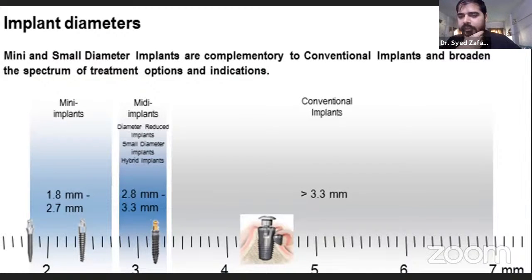Okay, I have covered my topic of flap planning, atraumatic extraction, and how you will extract the tooth, what the protocol is for bony defects, and when you place the bone graft or the membrane. Now I will give you a little bit of the concept of the implant and what kind of diameter, angulation, and position we will use.